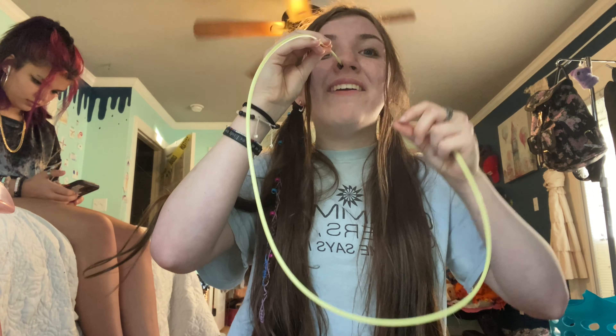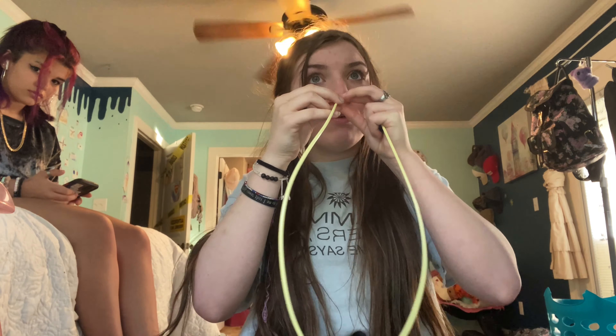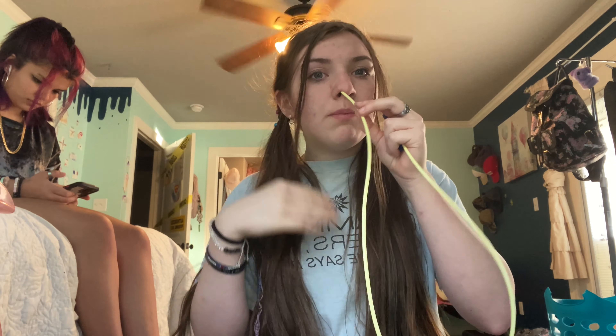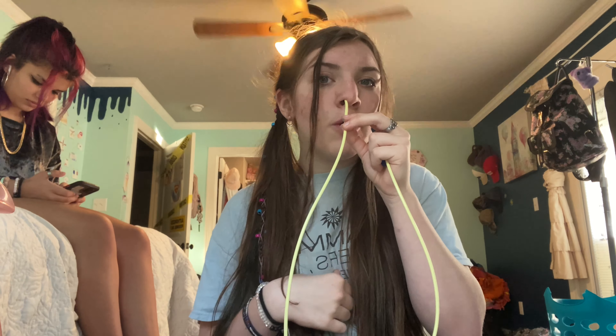Right now, if you can't see that, it's back in the back of my throat. That is going to be the hardest part. When you're first learning, that's the hardest thing — to get it past there. But I think the more you do it, the easier it gets. You want to keep swallowing because it makes sure the tube goes down your throat. Some people swallow water with theirs, but for me that doesn't help because my body just doesn't like swallowing water for some reason.